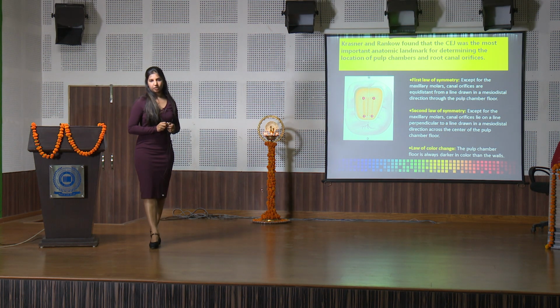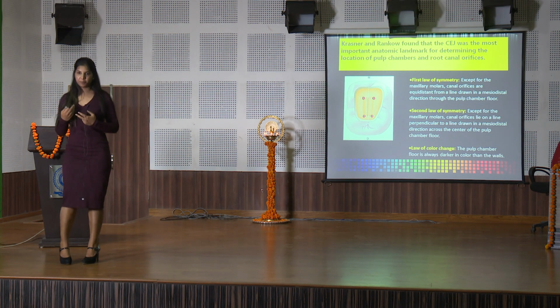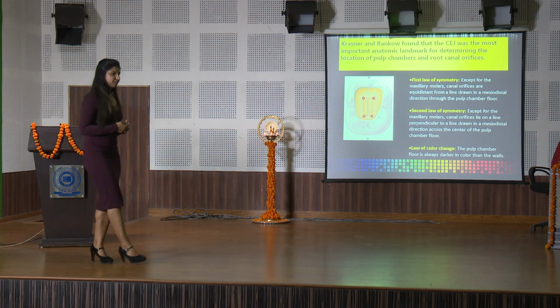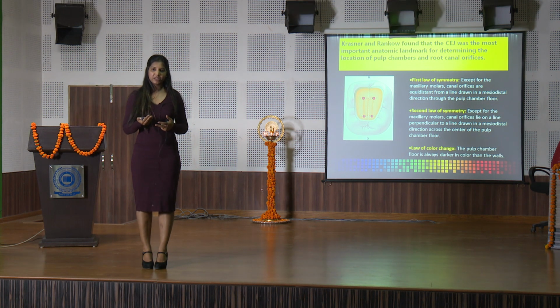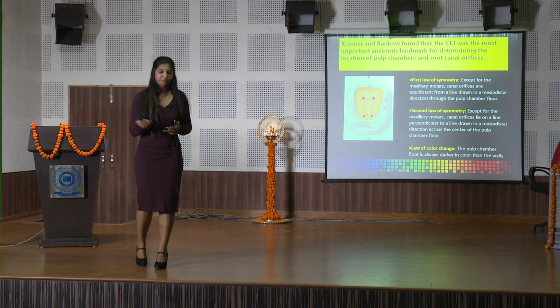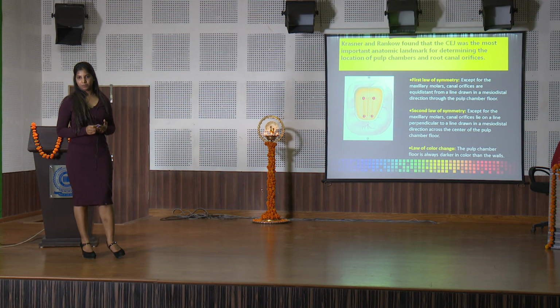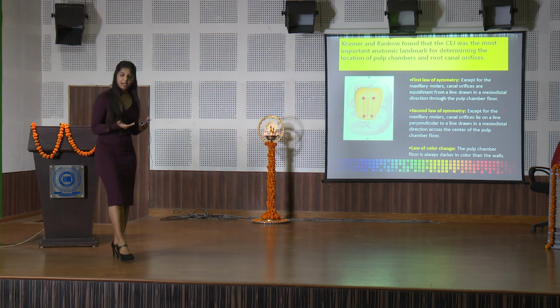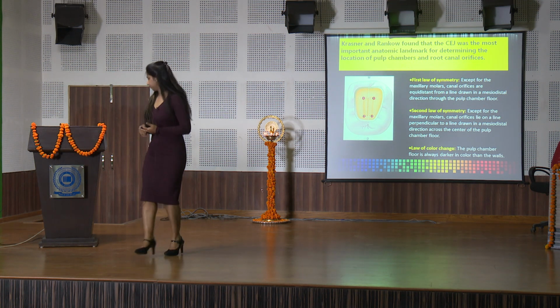So we are going to go to the third law now. Third law is the law of color change. It is again of enormous help for the beginners, as a lot of times when you begin with root canals and you're very scared that you might end up perforating, you'll just go to the DEJ, remove some dentine and wonder if the canal is calcified, if the pulp chamber is calcified. How do we distinguish? Floor of the pulp chamber is always darker in color than the walls. So that gives you a clue. If you are into the pulp, floor will always be darker than the walls, while if you are into the dentine, dentine will have the same color whether it is floor or the walls. So remember that.